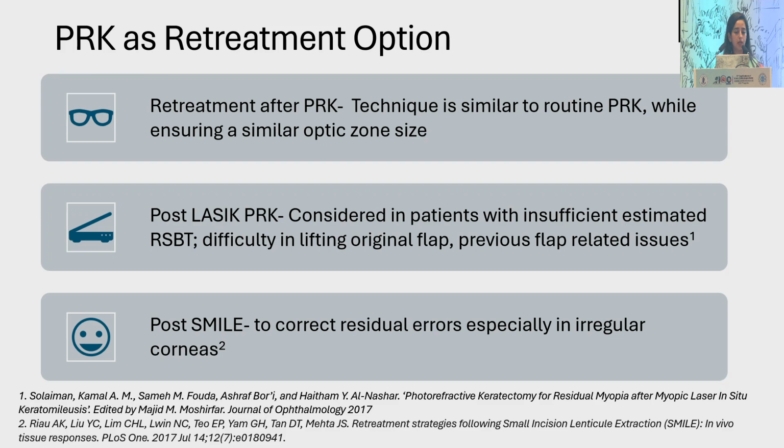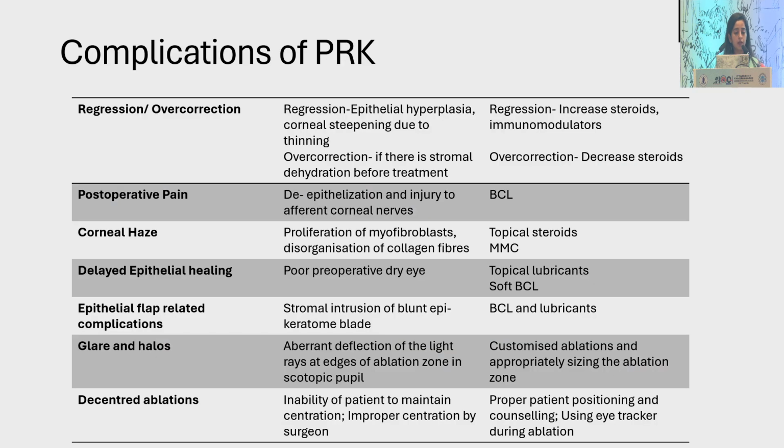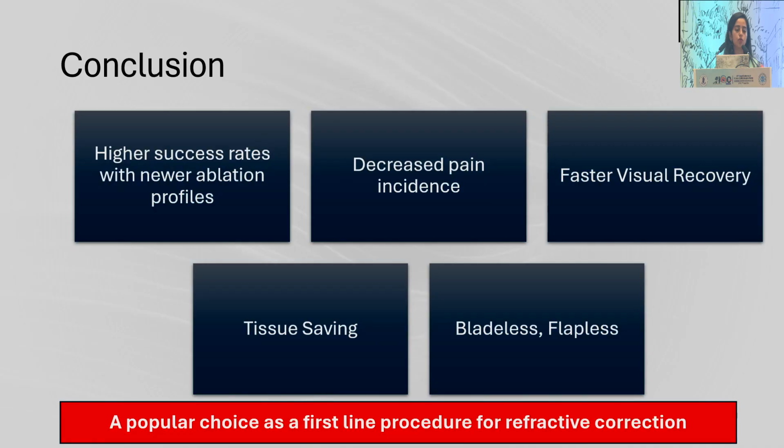PRK is also popular as a retreatment option, especially after LASIK as well as after SMILE. And these are the various complications which have already been discussed in the previous slide. So to conclude, I would say that higher success rates with newer ablation profiles, decreased pain incidence, faster visual recovery, tissue-saving technology, and since it is bladeless and flapless, all these features make it a popular choice as a first-line procedure for refractive correction. Thank you.